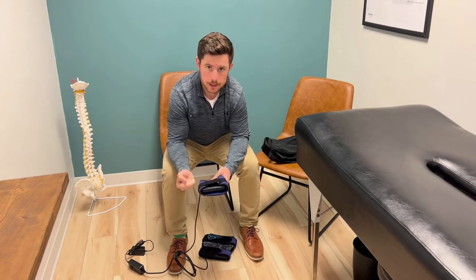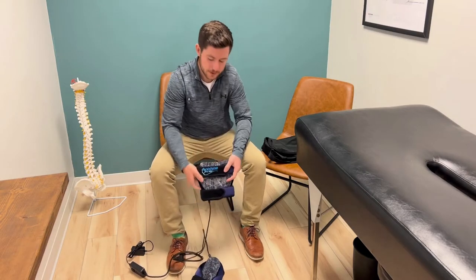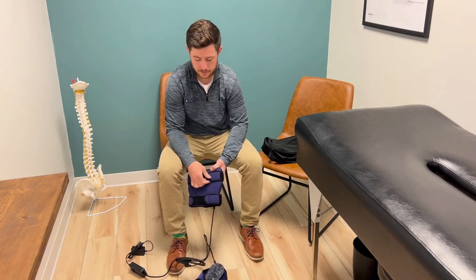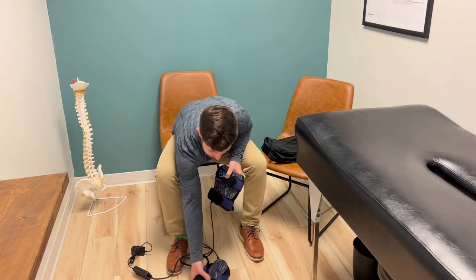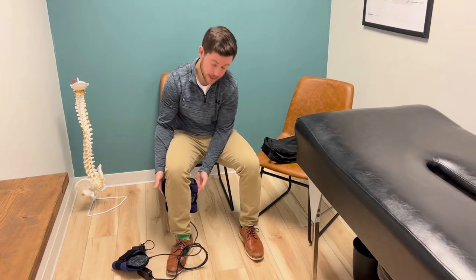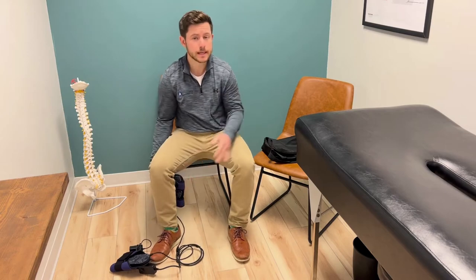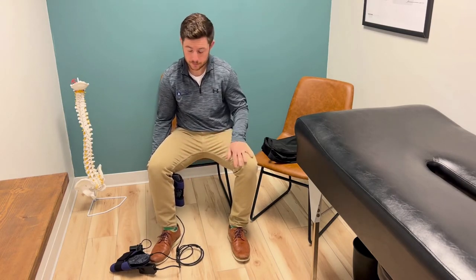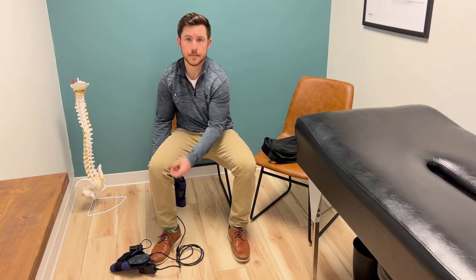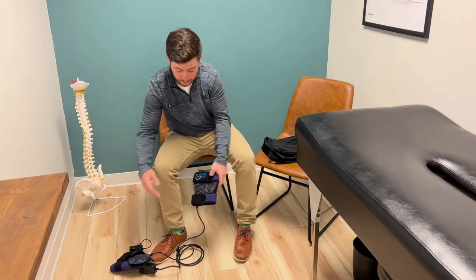When velcroing this, it doesn't need to be super tight — we just want it snug. The other pad is the calf pad. We've got velcro that you can undo; you'll wrap it up and around the leg, right below the knee on the calf, as you can see here. Then you'll strap it up and around — snug, but it does not need to be super tight. We just want to make sure it doesn't fall, and make sure that it's directly on skin, just like the one on the foot.